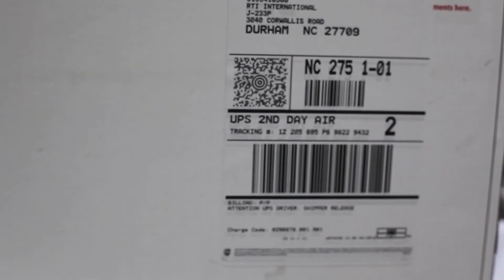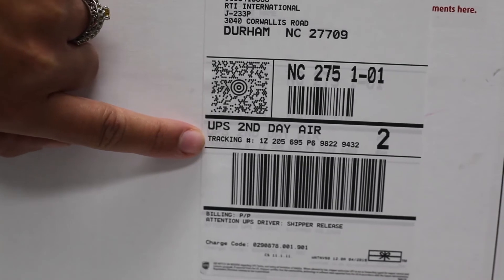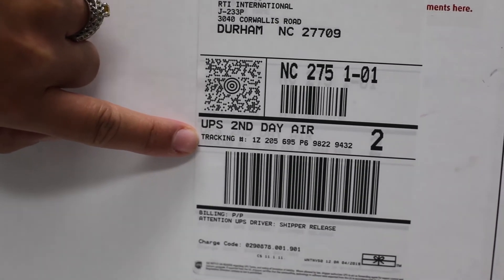You will need to give UPS your phone number and the tracking number for the shipping label. There is no charge for you to ship these samples to the lab — the return mailing label will be taken care of.